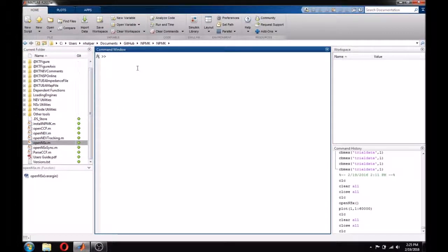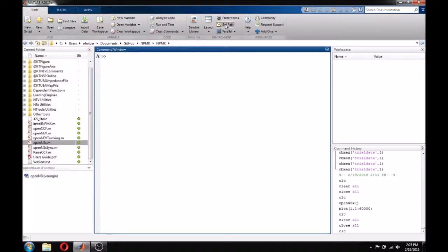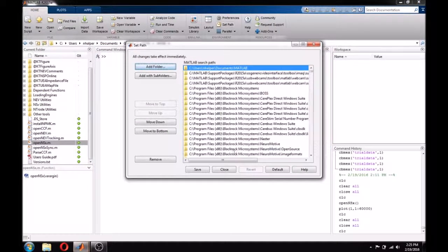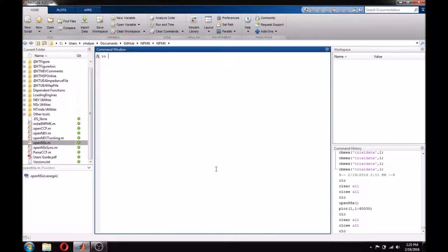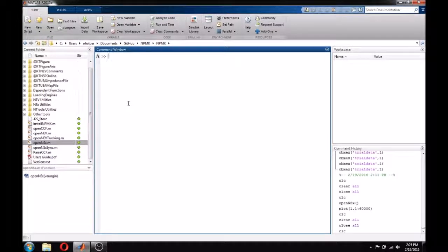To get started, make sure that the NPMK is set on your path, or that you are within the NPMK folder, like I am here. Both OpenNEV and OpenNSX can be found in the main folder of the NPMK.